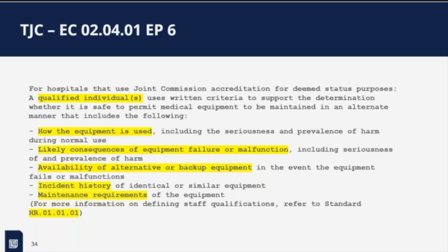And then the maintenance requirements of the equipment. If they're monthly for some reason, there's a reason that they're monthly. So how far can you go beyond that? How far do you want to take it? Is quarterly acceptable? Is every 2 months? Do you build that over time? Hey, we switched from monthly to every 2 months, and now we're still good. So maybe in 3 more years, you justify that and go to every 3 months. Maybe it's not all at once. Maybe your goal is to get to a much longer frequency. But if you start seeing more failures or more incidents happen in that time, you do want to make sure you're noting that as you go through that.